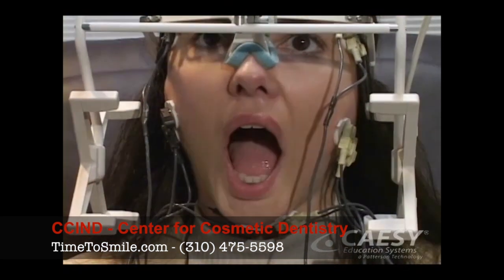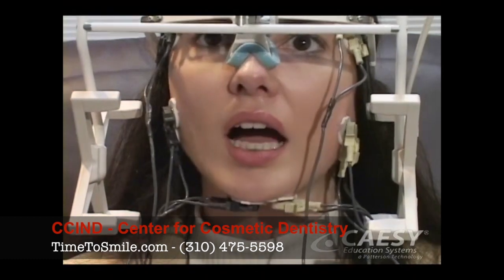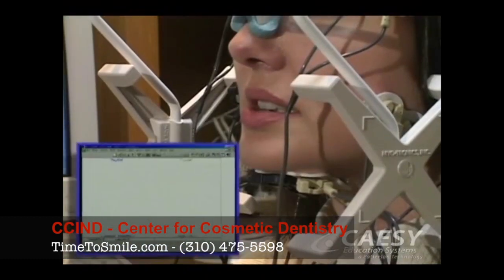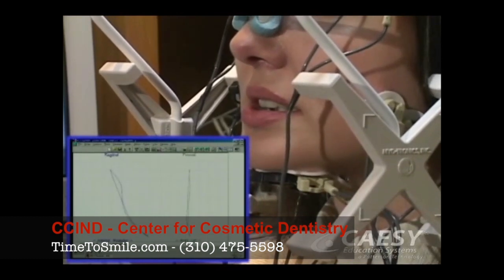To track your jaw movements, we'll place a tiny magnet just below your lower front teeth. The sensor array then records the movement of the magnet when you move your jaw open and closed, side to side, and forward and backward.